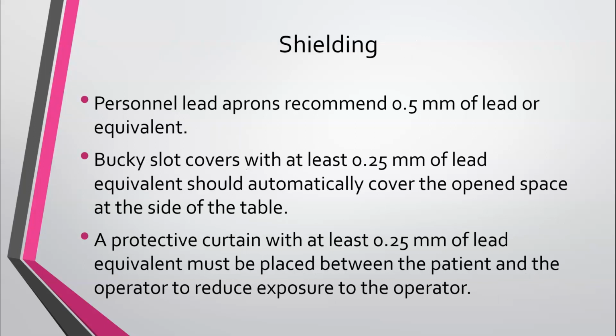All right, shielding. Shielding is recommended at 0.5 millimeters of lead equivalent. The Bucky slot covers and any protective curtains or gloves should be at 0.25 millimeters of lead.